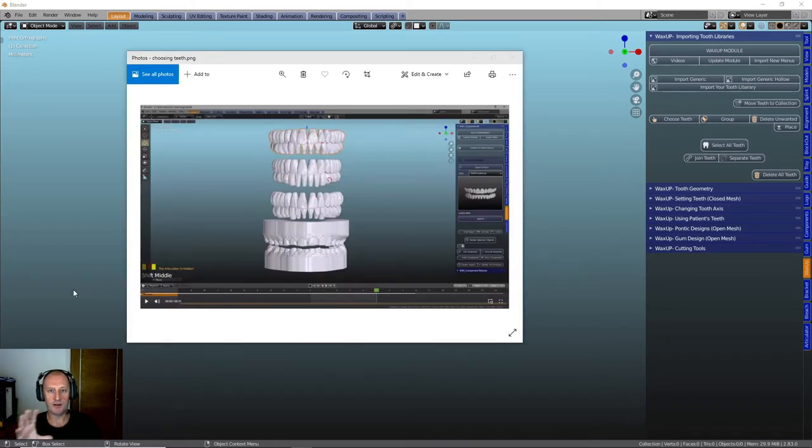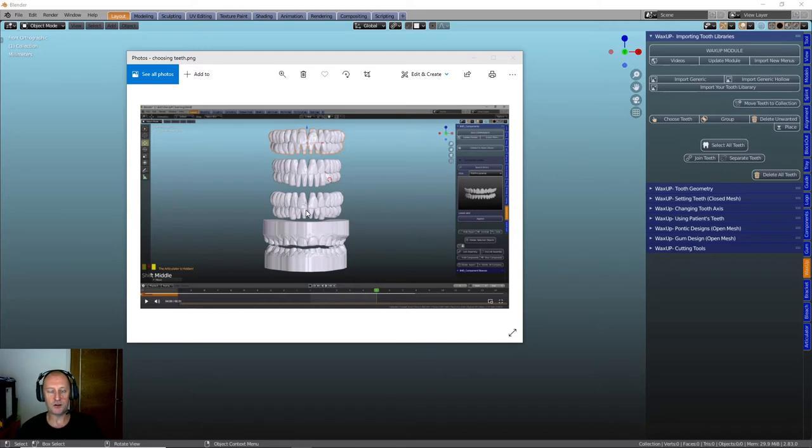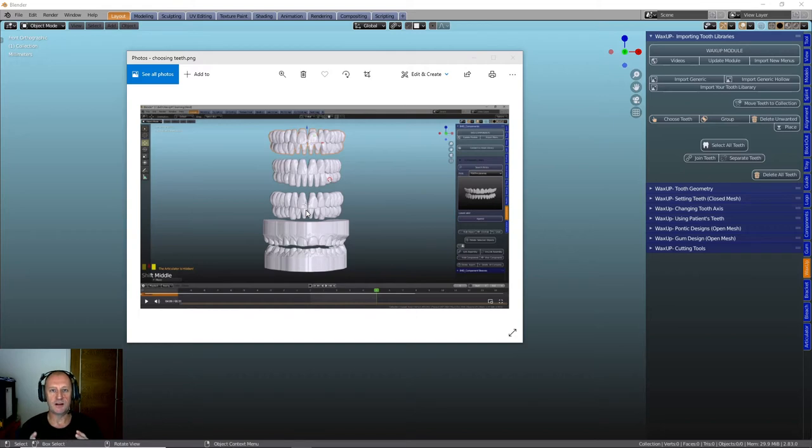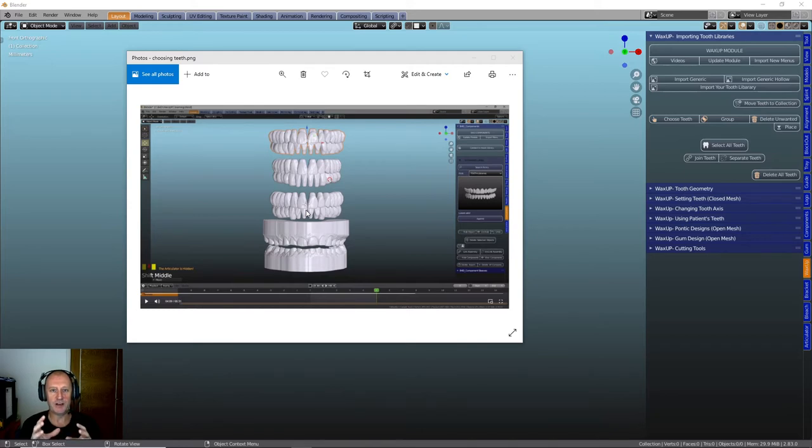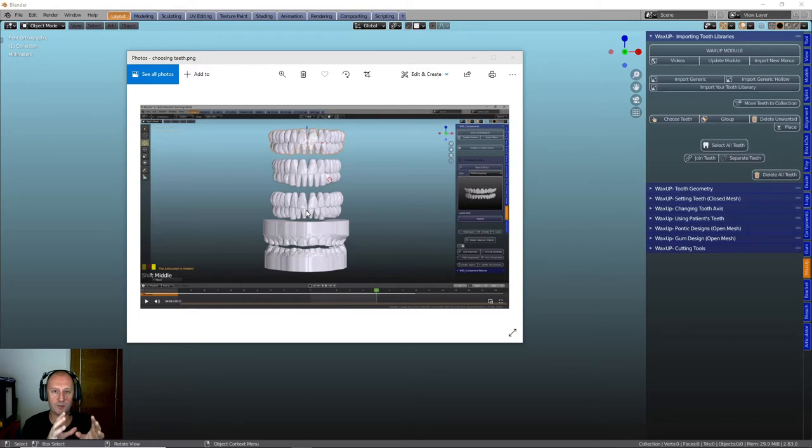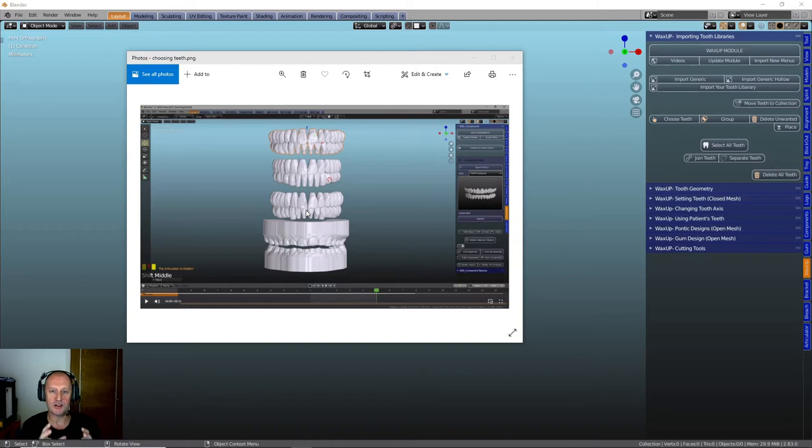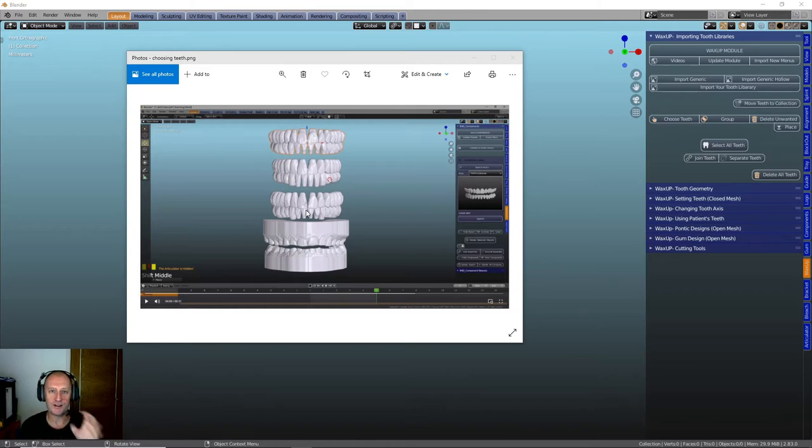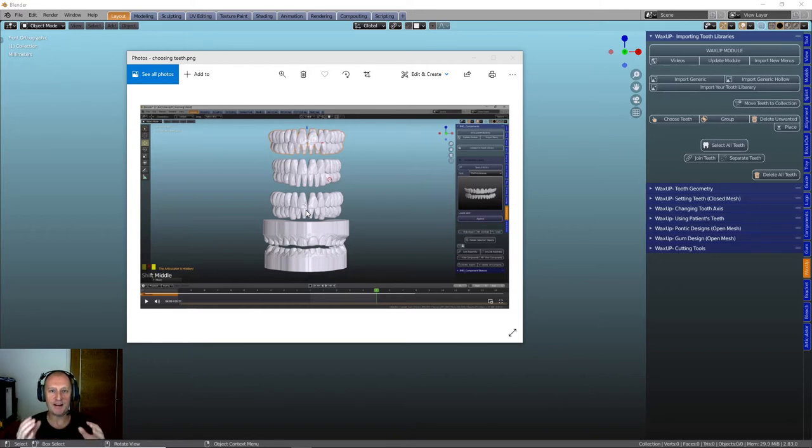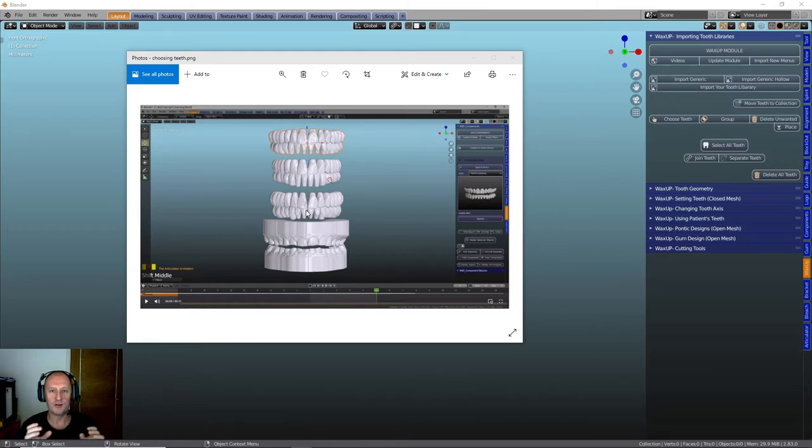This is what I mean about putting different types of tooth library within the environment. So, if that's your jaw you're waxing up, you can put in as many tooth libraries as you want in there and you'll be able to very quickly see which tooth library fits the case a lot easier, a lot better. And when you snap those, the nice thing about it, once you put the model through the articulator, the software uses that alignment stage to snap the teeth to the model. So, if you get that right and it works really well when you want to put six fronts in and you snap them to the model, I'll show you that in the next menu, and it fits, they fit really well in with the original dentition. So, it allows you to only make the small, minor menu changes to get the teeth in the right position.